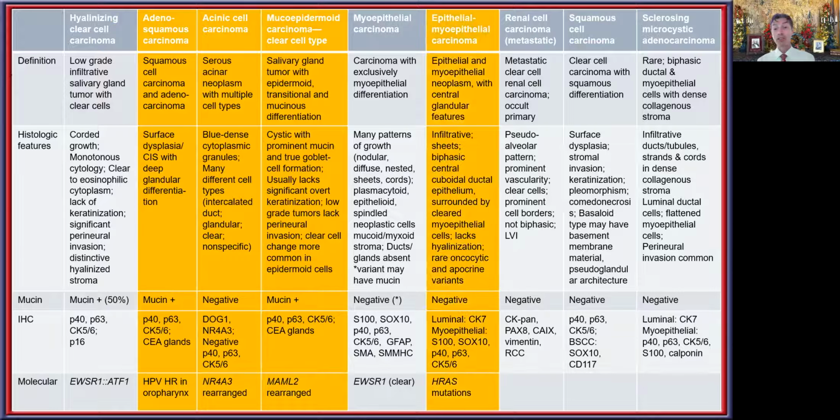So let's go on now to one of the next categories after squamous cell carcinoma, adenosquamous. This also is not particularly a salivary gland tumor category, but it can develop in the upper aerodigestive tract as a biphasic tumor that shows both squamous cell carcinoma and glandular or adenocarcinoma in aggregation. Now, when one thinks about the oropharynx as an anatomic site, they are very frequently associated with HPV in that particular location. So there is a blending of the squamous and glandular components in many cases.